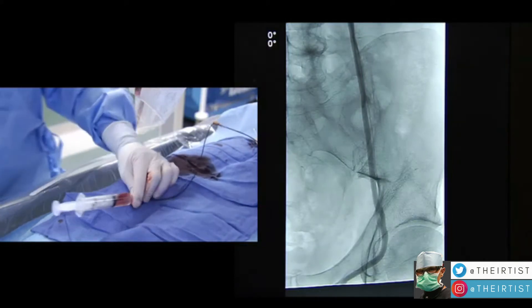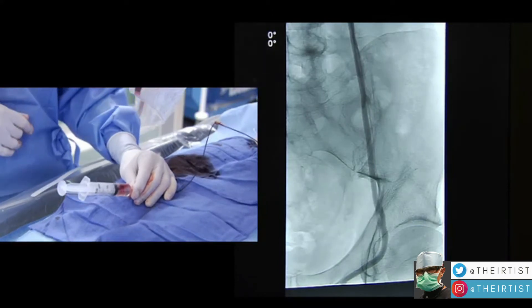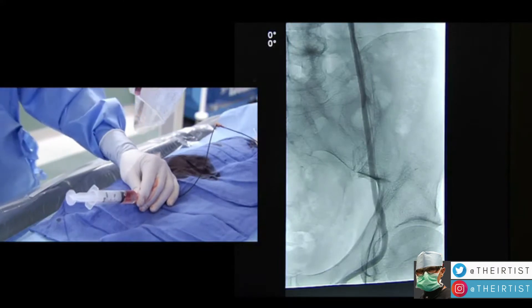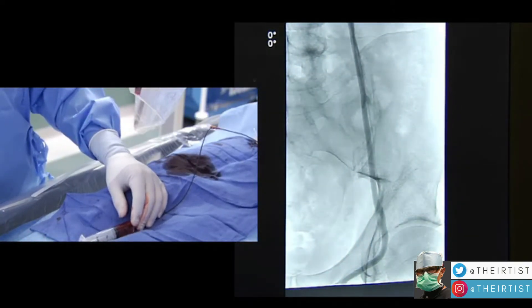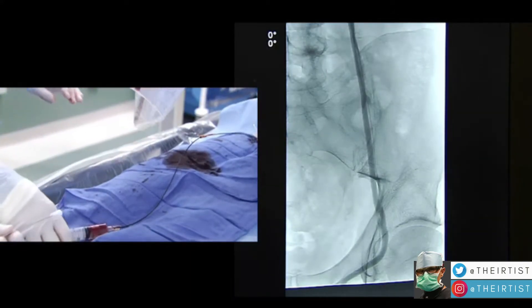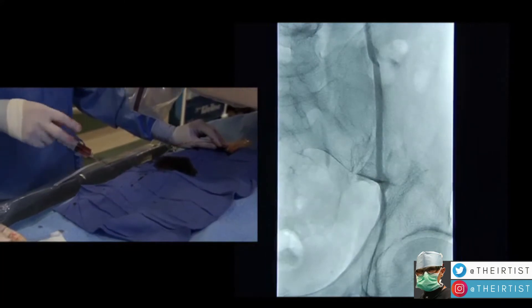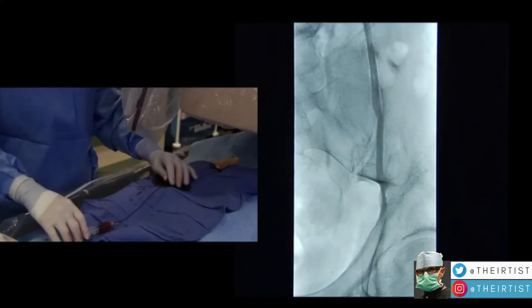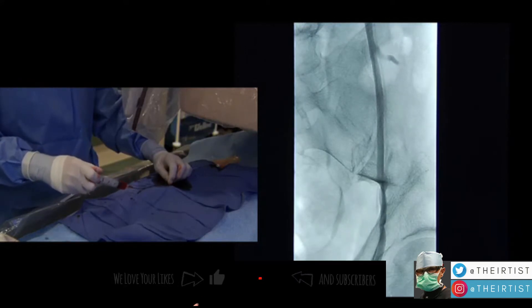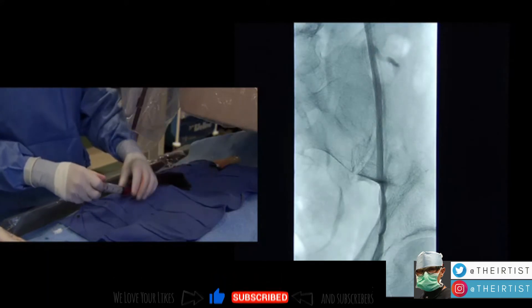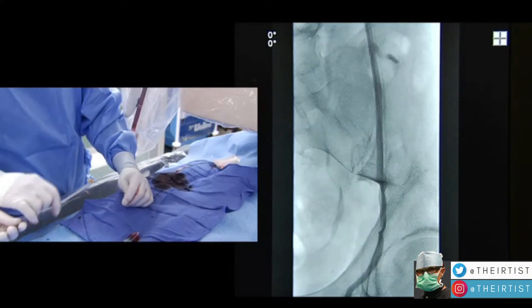The physician now prepares the coils to be placed and delivered through the small catheter. As you can see, this is an unedited live case — the procedure is fairly quick. The first coil is advanced using a glide catheter only, without a guide wire. This type of catheter is non-traumatic to the vein and can be torqued in different directions. Once in good position, the physician decides the most appropriate location for coil delivery.